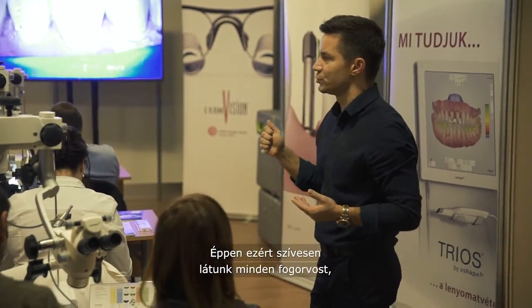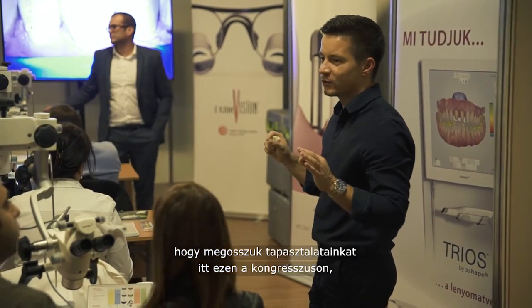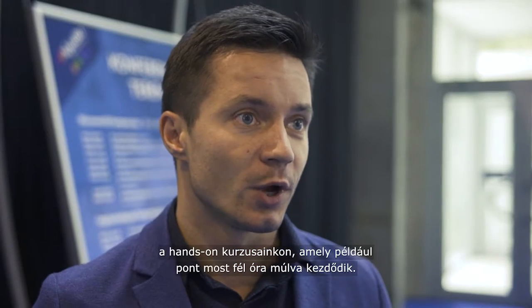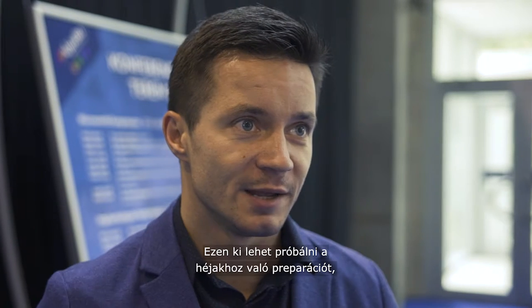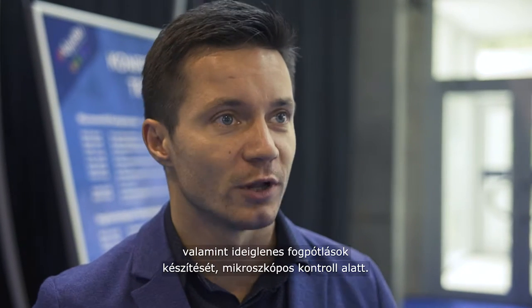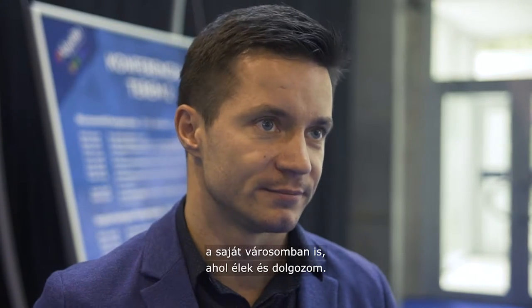We welcome all dentists — this is what we share during congresses, what we do during hands-on courses, and what we are going to do in half an hour right here: the hands-on, doing the preps for veneers and making the provisionals under microscope control.